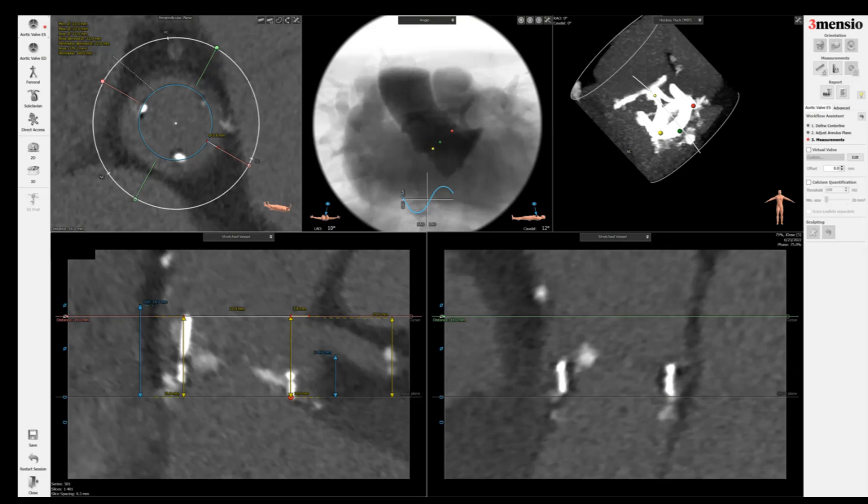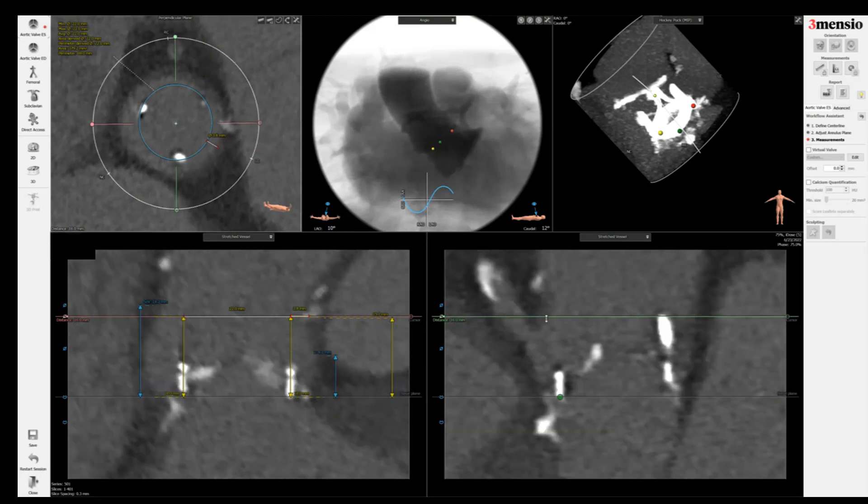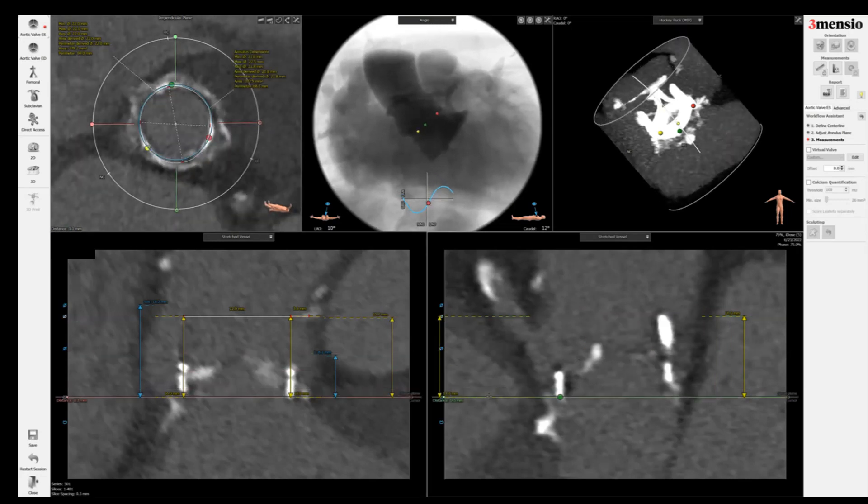Sometimes if I look at this quickly for illustration, you can see in this particular case the top of the surgical valve does line up with the sinuses and the STJ here. But if the right coronary is higher, you'll be less concerned. Or if the right coronary just comes across it, you're going to have to measure the distance here. I also want to measure the distance to the right coronary, because while it's not common for the right coronary to have obstruction, you certainly don't want that to happen.